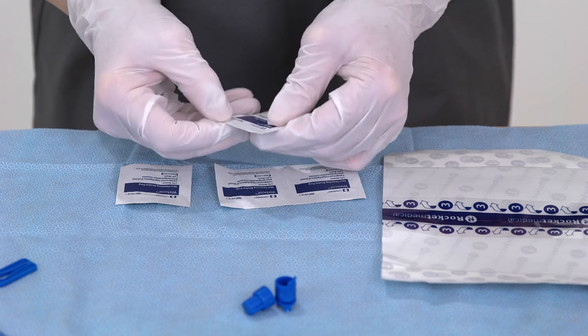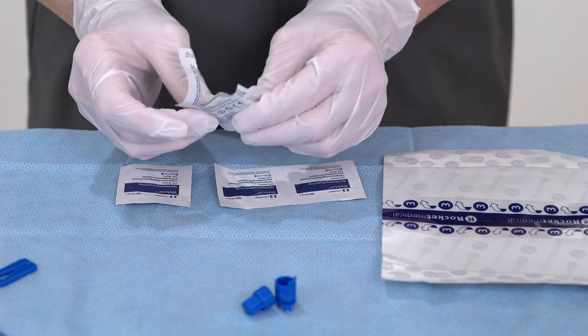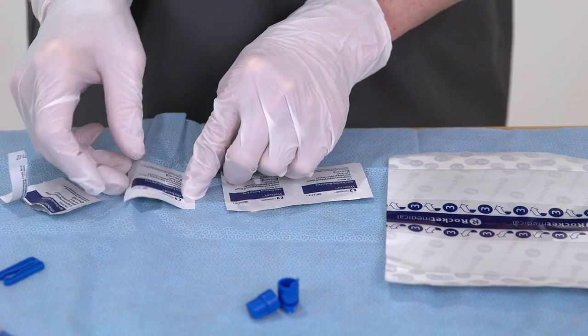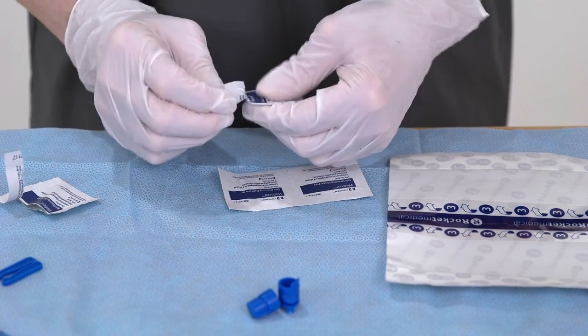Tear open the four alcohol wipe pouches, but do not remove the contents. Place these on the sterile field away from the rest of the items.